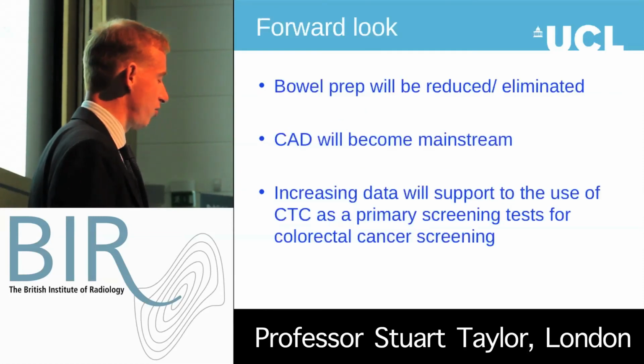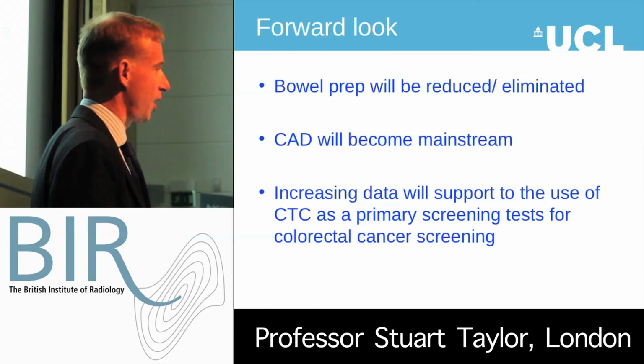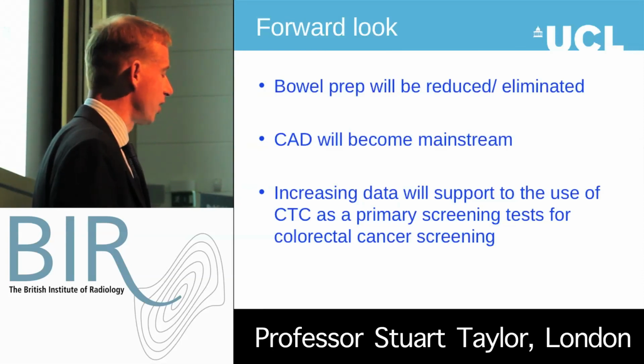And my forward look for the next few years, we'll get rid of bowel preparation, we'll turn to non-laxative protocols. We'll all be using CT colonography in the next few years. And I think it will start to roll out as a screening test, but perhaps in countries where we don't have a national government funded screening programme, but in more ad hoc systems.